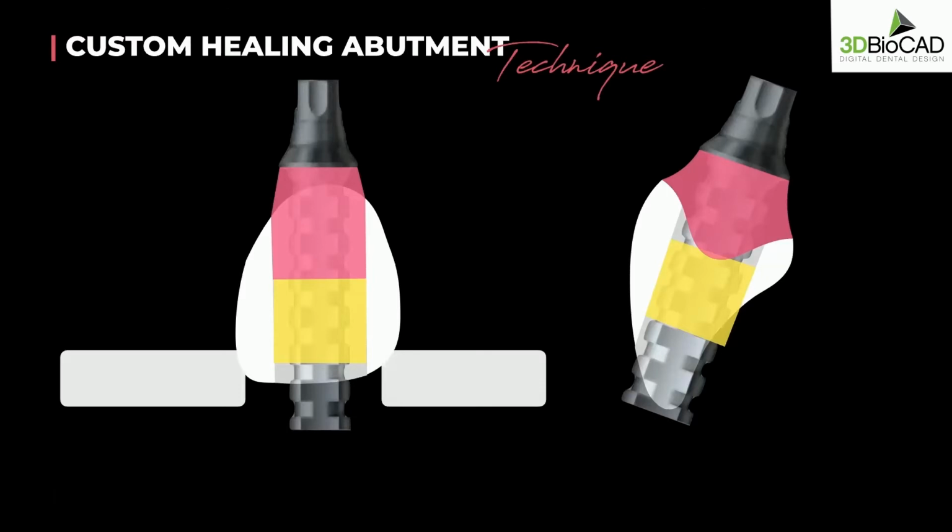Now, the whole purpose of doing these custom healing abutments is to support the soft tissue. If we make the custom healing abutment subgingival, then obviously it's not doing the supporting. So in these cases, we want to make sure that we leave some of the custom healing abutment above, or at, the gingival margin.